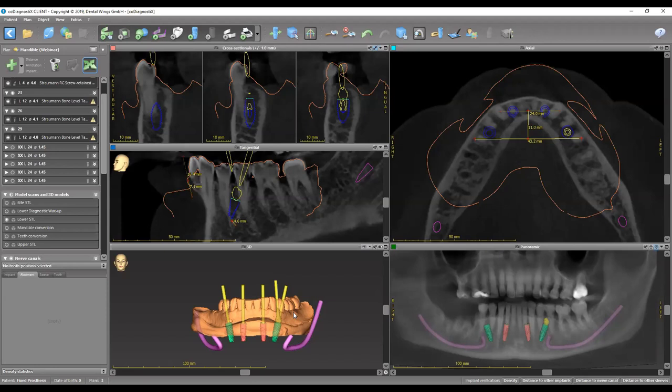So you can have a second bicuspid and a first molar occlusion on each side. This is how we measure the AP spread with just four implants — the minimum for a fixed prosthesis in the lower and upper arches. But as mentioned, you can have more than four implants — up to six — according to your preference.